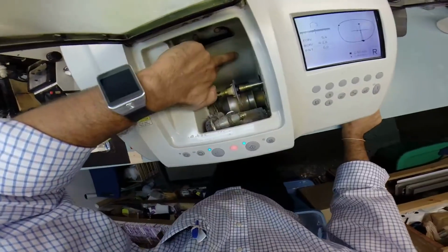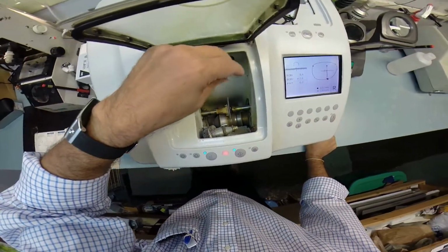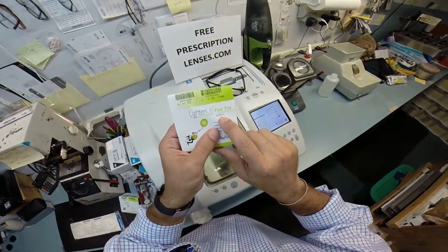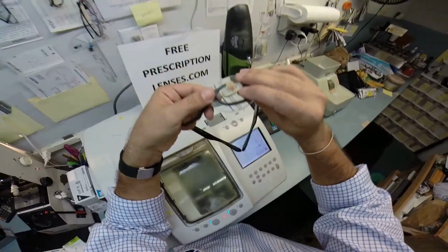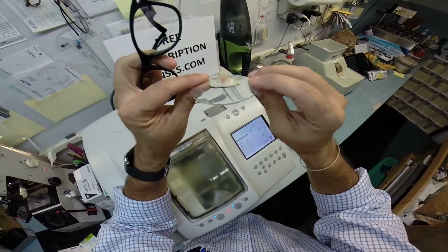Now it's actually putting the bevel onto the lens. If you can see, water is running in the background. That's just to collect the optical sawdust. Polycarbonate cuts dry where plastic and high index cut wet. But as I was saying about the aspheric lenses, a spherical lens is round in every direction. It gives you an ugly cosmetic fishbowl appearance. These are aspheric, which is a much flatter curvature. It gives you a much wider field of view.